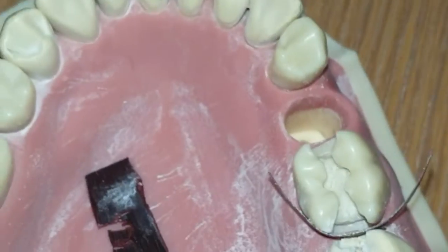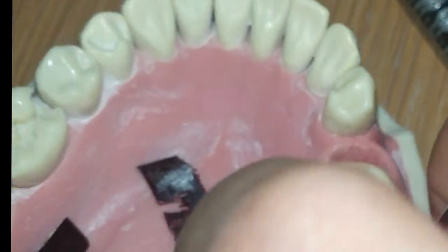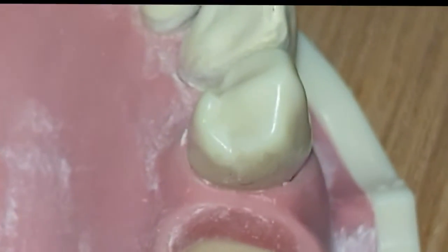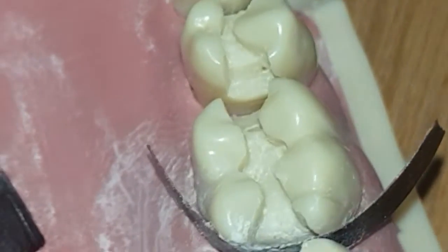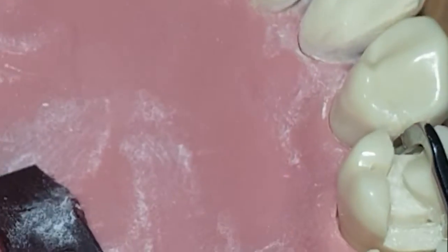Let's see the canine's proximal surface — the distal surface — whether I have hit the canine or not. Only with the hand instruments I slightly touched it, but I don't think I carved it. There is no bur damage, just little scratches that I made while scraping off the proximal surfaces with the hand instruments. I did not bur the distal side of the canine. So I think that is forgivable — overlookable.